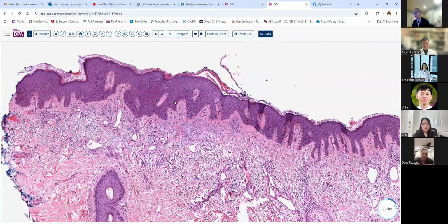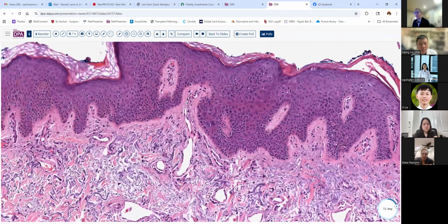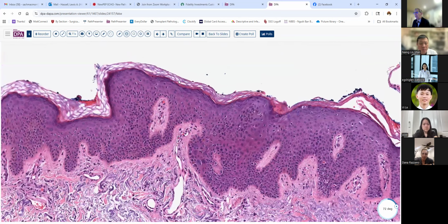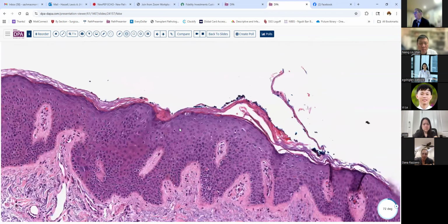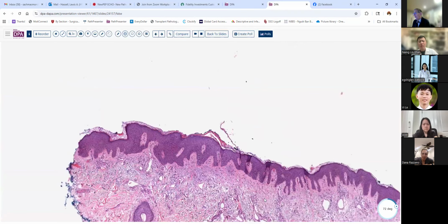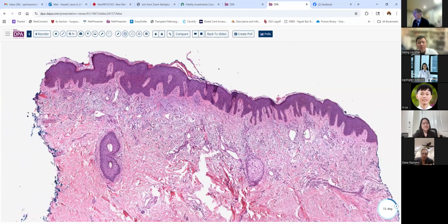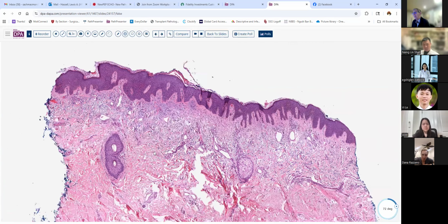Maybe we've got a little bit of squamous hyperplasia. I don't see anything else really too concerning here. They've got a few melanocytes along the basal layer, but they don't look particularly abnormal. Stratum corneum is a nice kind of thin basket weave pattern. There's no parakeratosis here. Well, maybe there's a teeny bit right there, but nothing that we can really point our fingers at and say, "Oh, this is bad news." We do have some vascular ectasia. You see these little venules here that are slightly more prominent, and that can either be due to the solar damage or perhaps to something else going on nearby.